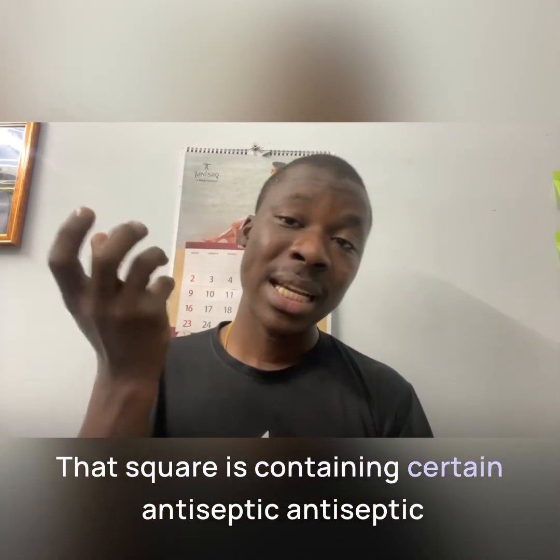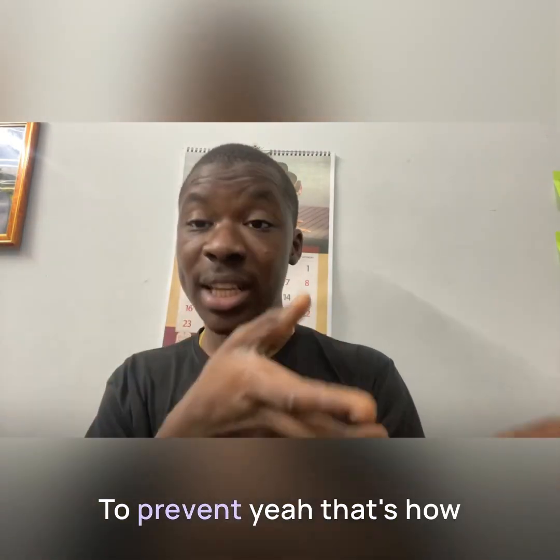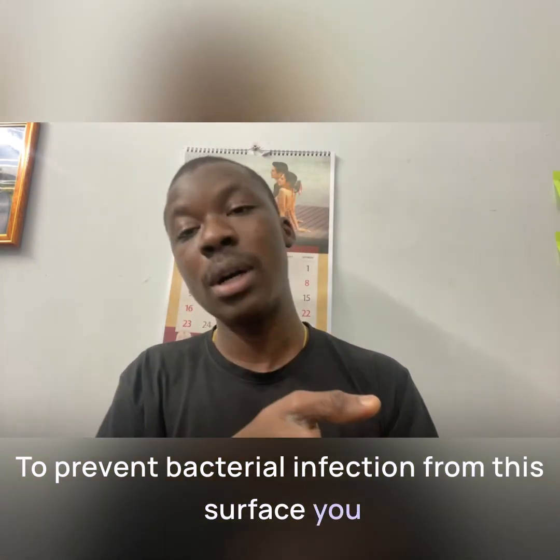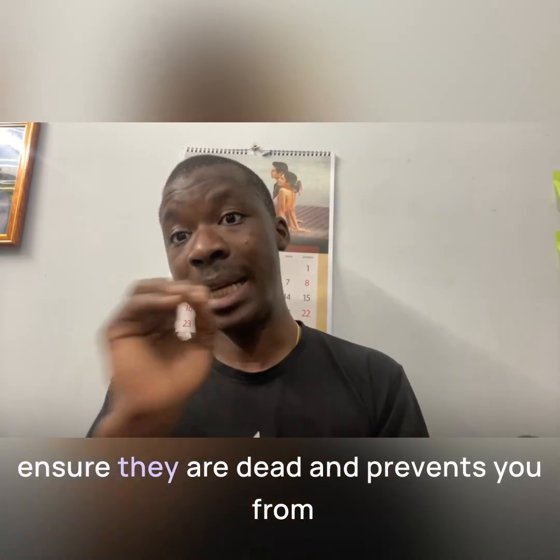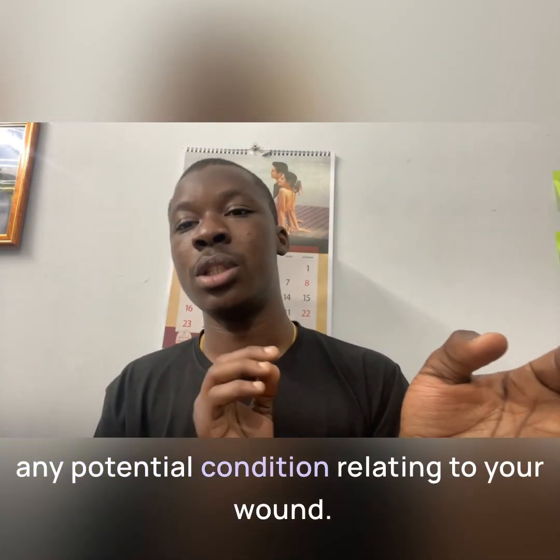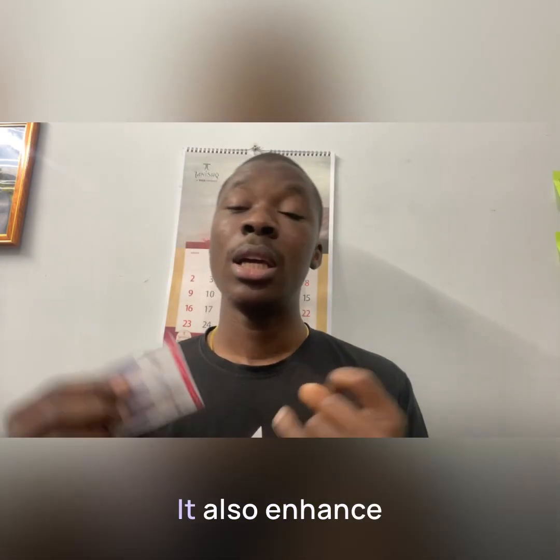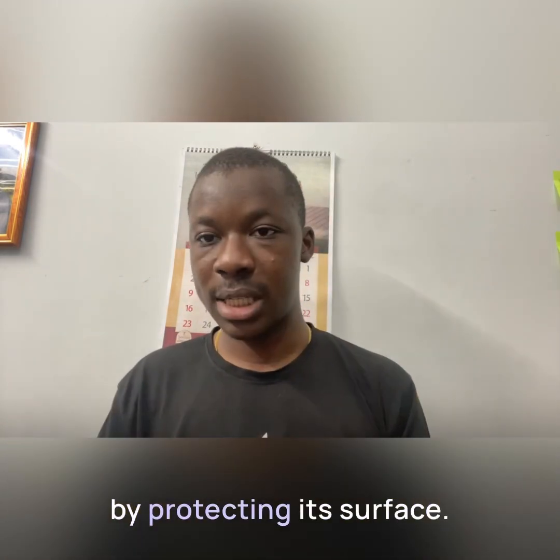That square contains certain antiseptic components, which help to prevent bacterial infection on the surface you apply it on, reduce the growth of the ones that are already there and ensure they are dead, and prevent you from having any pathological condition relating to the wound. It also enhances wound healing by protecting this surface.